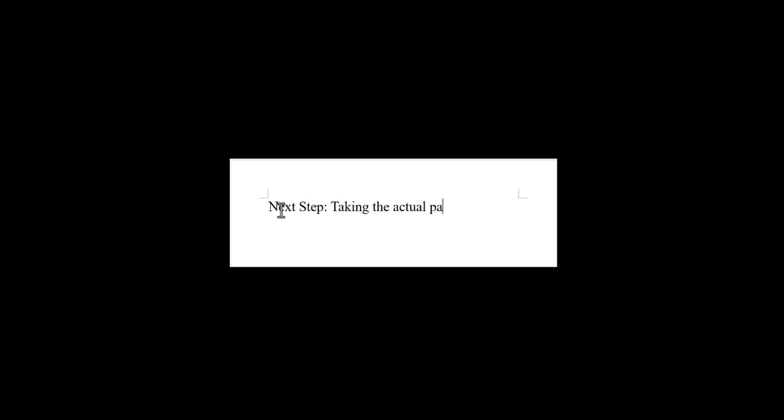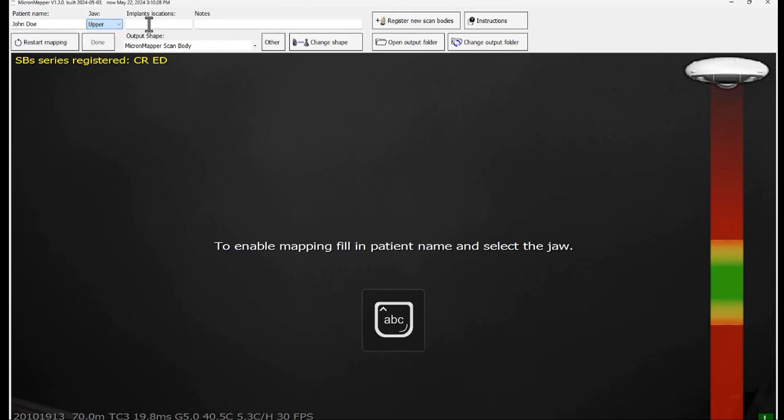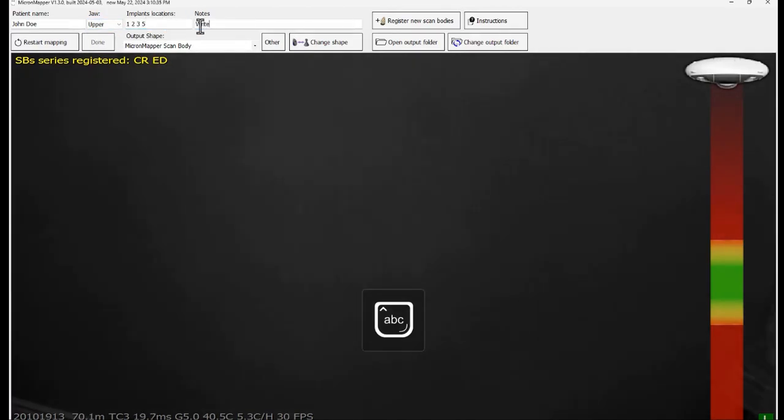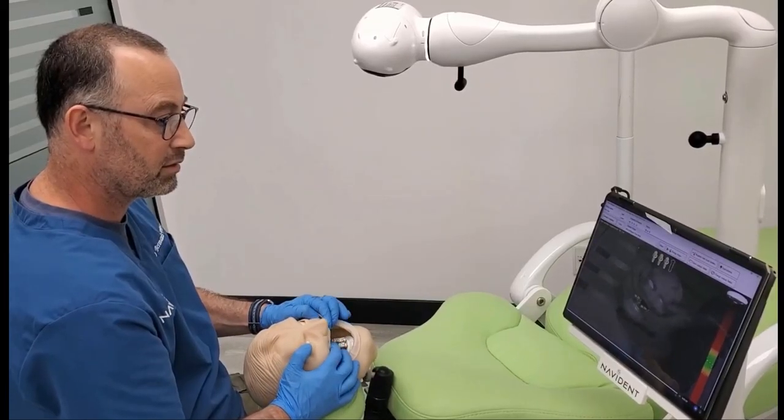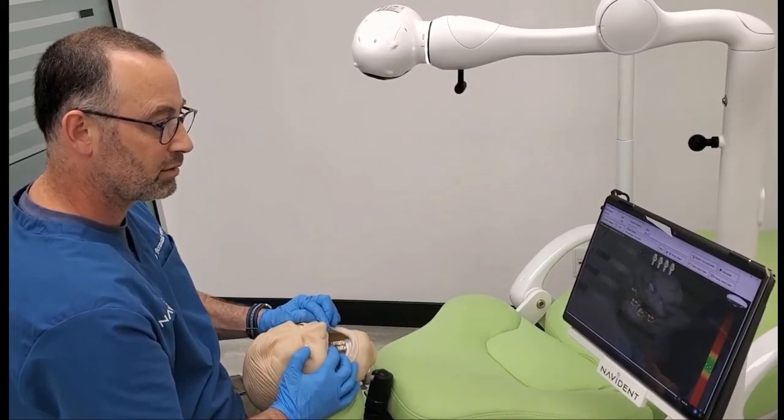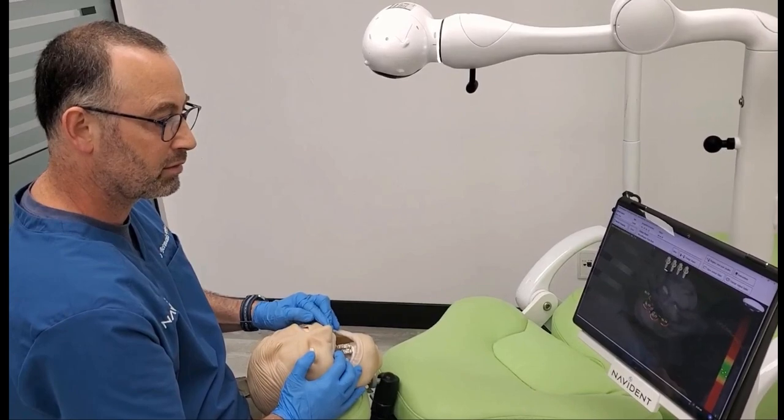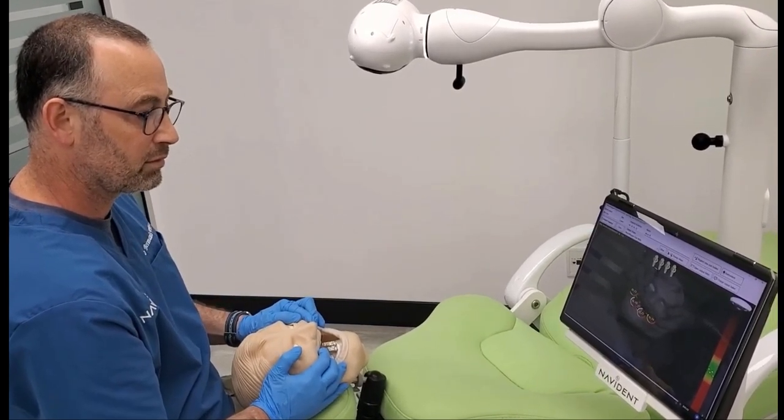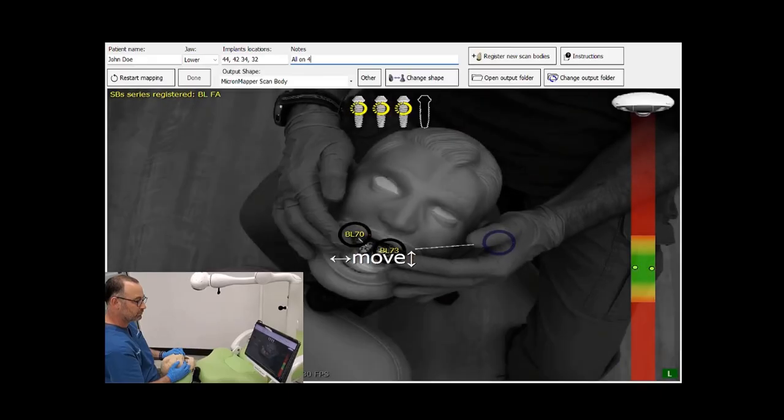The next step is taking the actual patient's photogrammetry scan demonstrated here on a model. Enter the patient's name and select the jaw. You may enter the implants locations and make notes if desired. Position the MT4 camera in the right distance from the patient's mouth and make sure there is a clear line of view between the camera and the scan bodies.